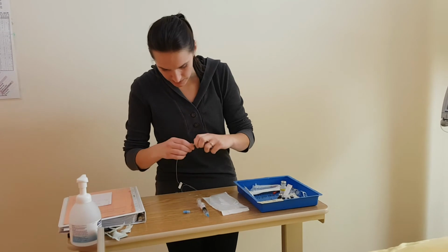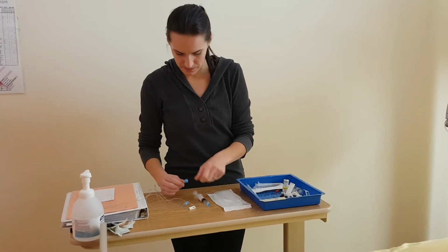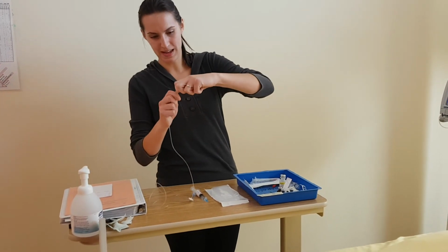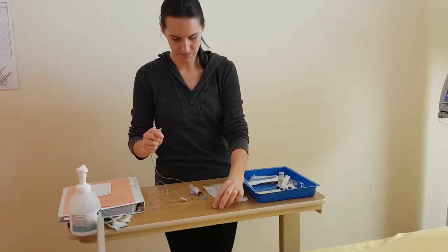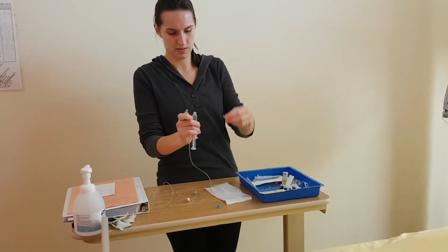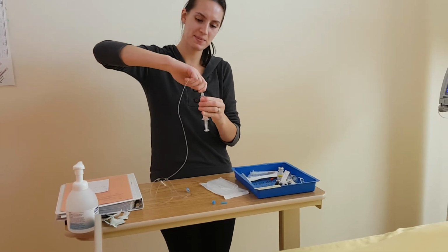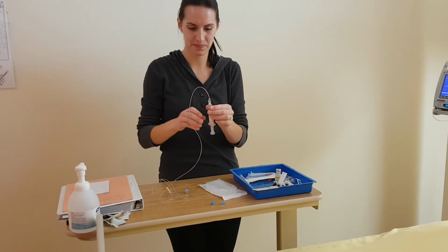So now I can further dilute my medication into my tubing that I have chosen here. I'm going to take this cap off here. It is not expired and the integrity is good, so I can use it. So I'm just going to swab the end of it for 30 seconds and let it dry for 15. Be careful again not to touch the tips to maintain its sterility.